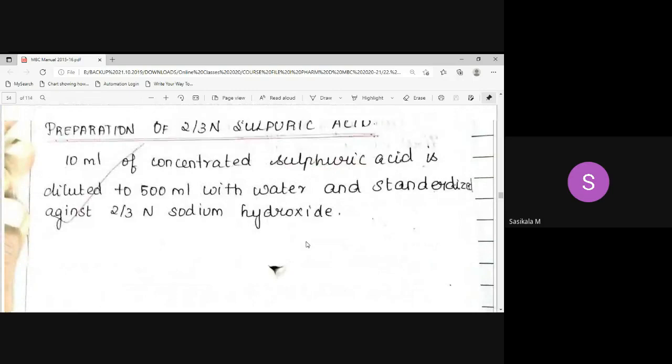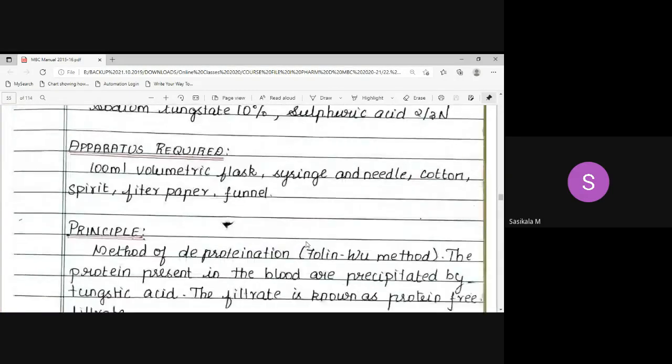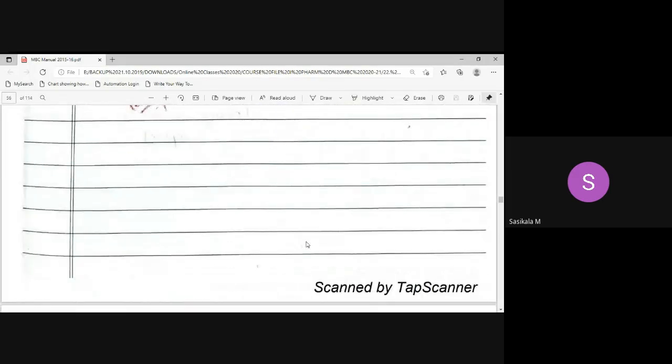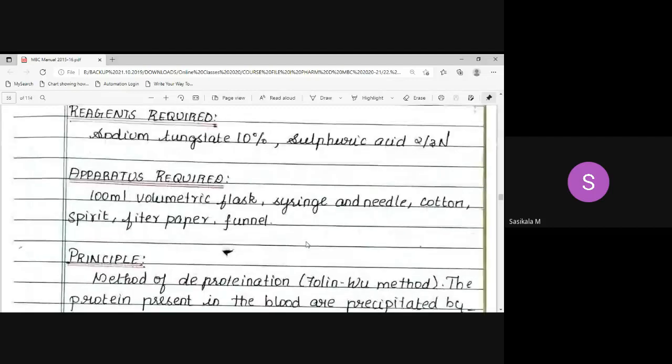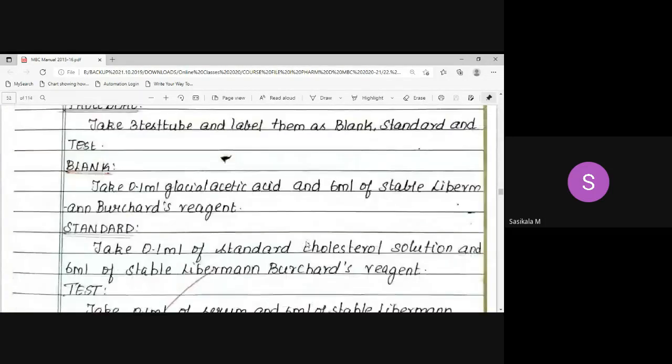And this is what we have discussed in the last class, that is preparation of whole tungstate filtrate. So already all have done. That is good. So the 8th experiment they have performed as 7th experiment. So you have got the result now. Okay.